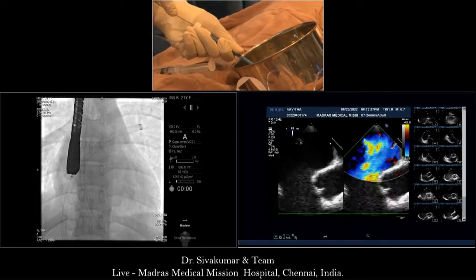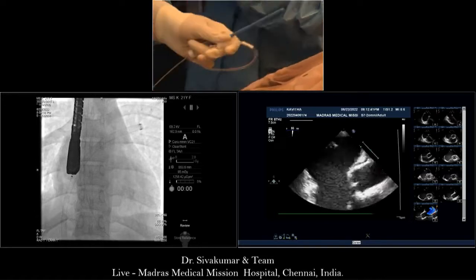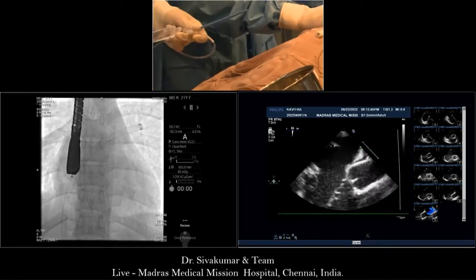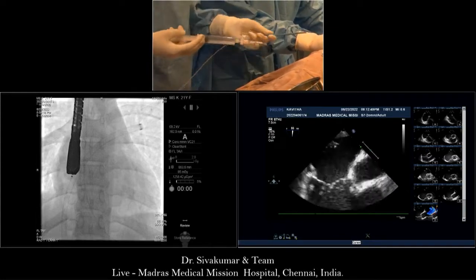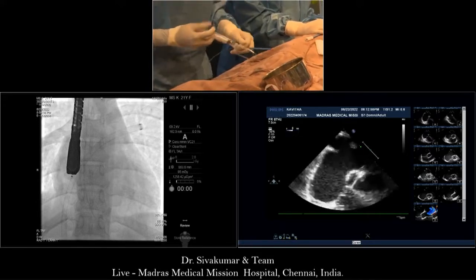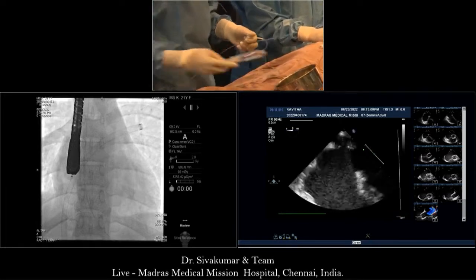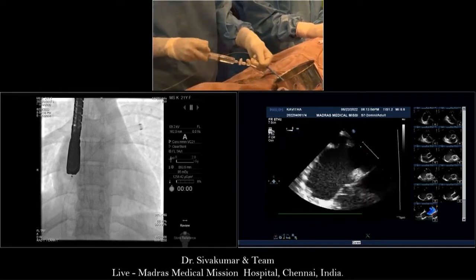Hold on. I want you guys to say just a number. I don't want a question. So give a number with 2 digits. 29. 31 was the maximum. I give up. I was trying to get Zahid to commit himself. 32 or 34, that's 4 digits, but that's fine. Okay, Shiva, go on. No, it's 31.